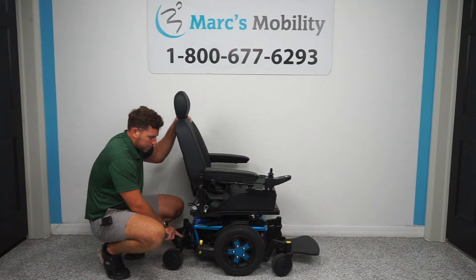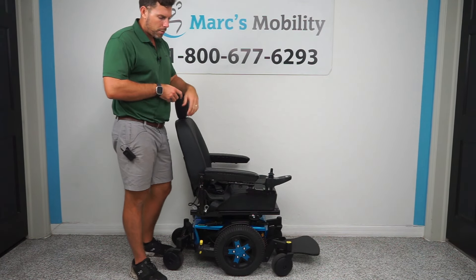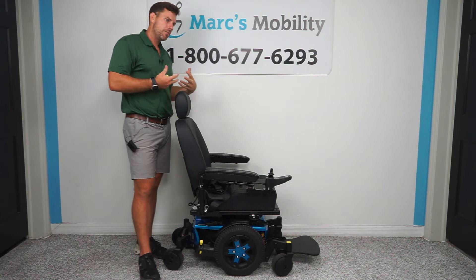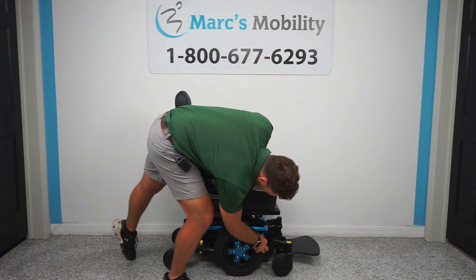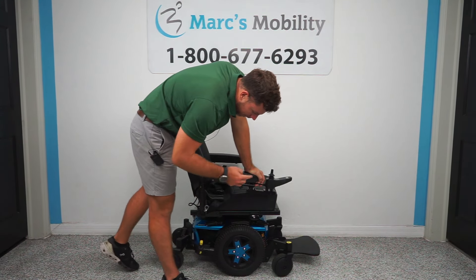Quantum has come out with amazing suspension. They actually have these gold suspension units on their latest Quantum Edge 3 units and some of their other newer units. This was designed specifically with motocross in mind, so it's a very, very comfortable ride. They do have some adjustability on the tension of these front springs, but not on the rear springs.